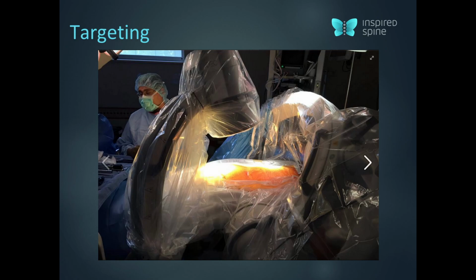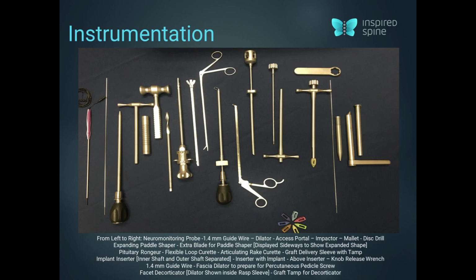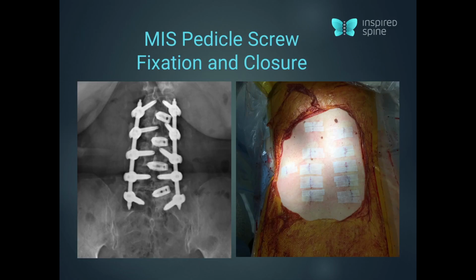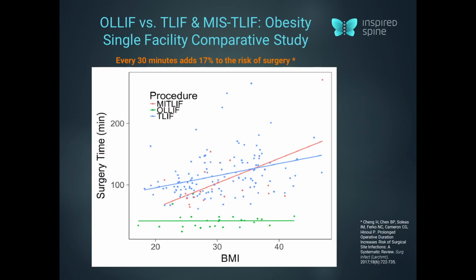The surgery is done with the double C-arm, and that enables us, with special instrumentation, to do the discectomy, prepare the end plate, and put a cage in. The result on the X-ray looks like a TLIF without any disruption to the posterior elements, and this can be done for multiple levels. The rate of infection is 0.16%, while an average rate of infection of 3 to 8% has been reported, and we have shown that this surgery can also be done in higher BMI patients without any additional risks. Thank you very much.